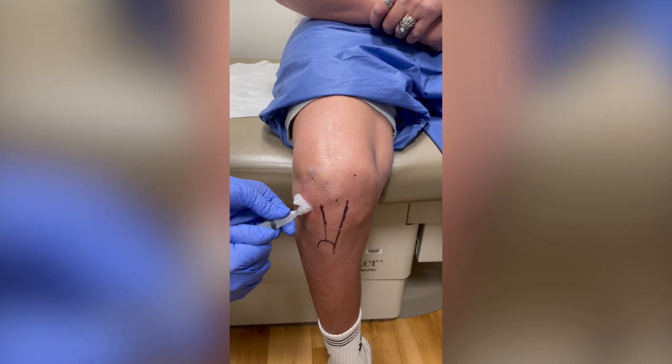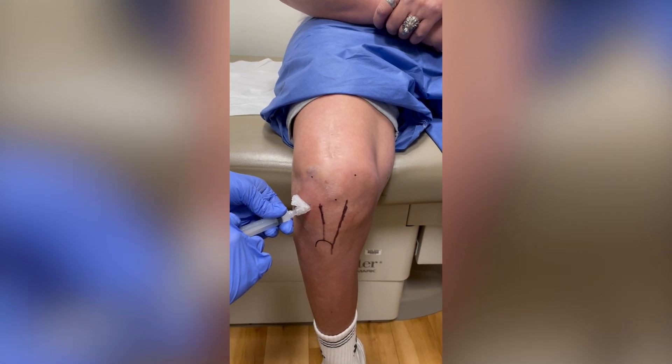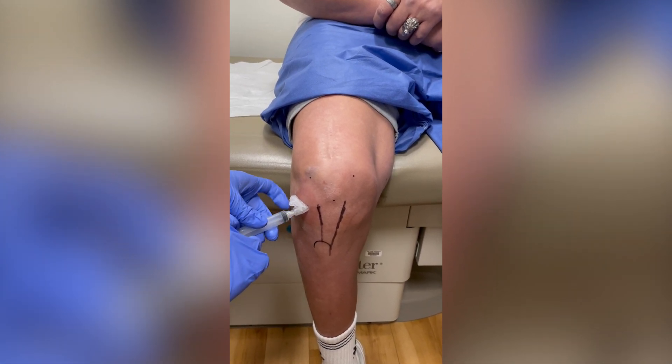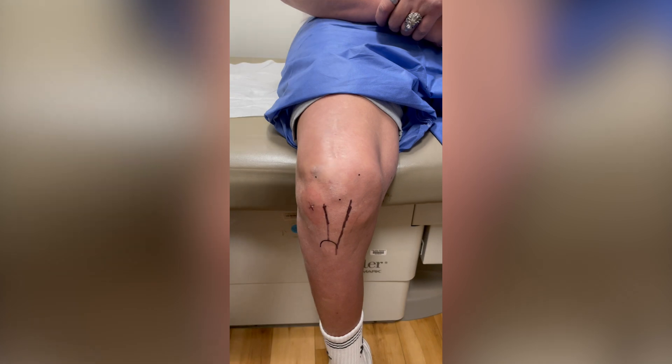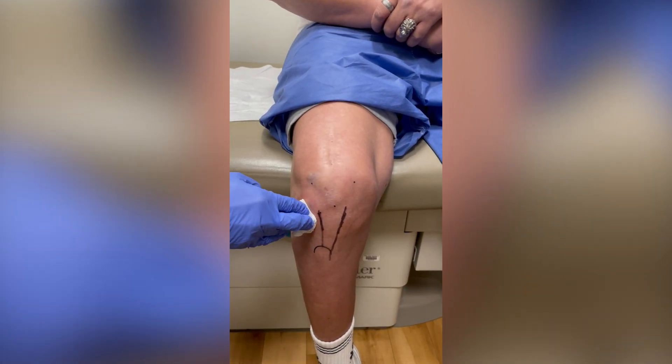Once in the knee joint, the injection should enter easily without much resistance. Following the injection, pressure is applied and the entry point is dressed with a bandage or dressing.